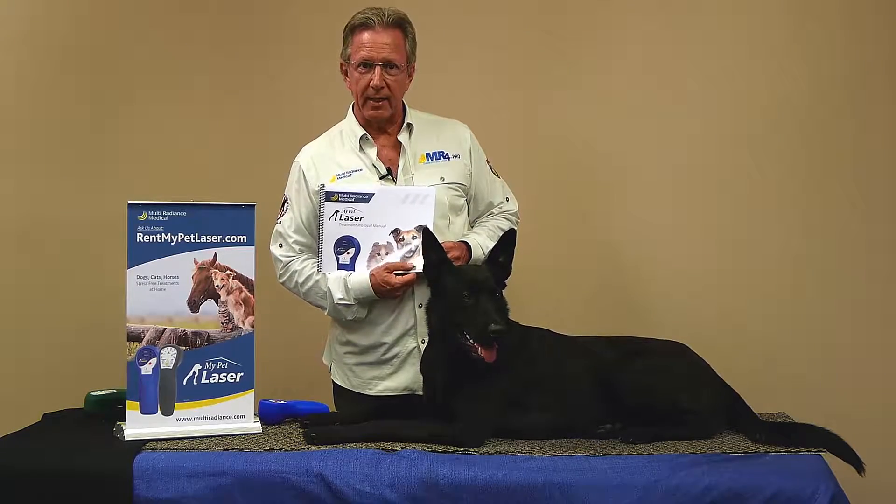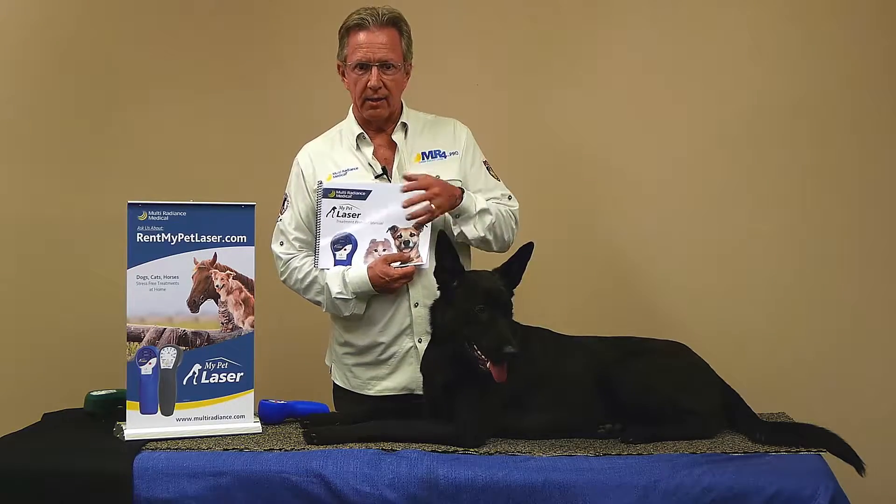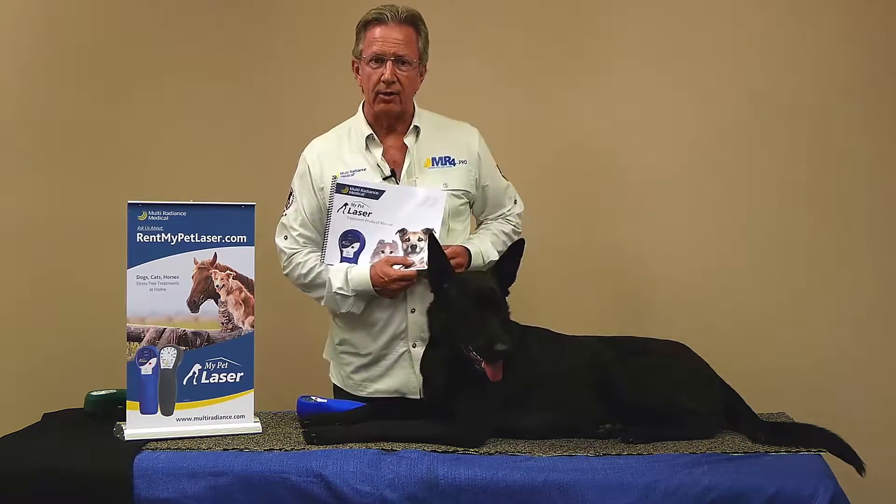Hi, Mark Strong back with you with Multi Radiance Medical. This is our My Pet Laser Rental Program. Your veterinarian can now rent these very safe lasers to you. Let's talk to you today about how you might use that.